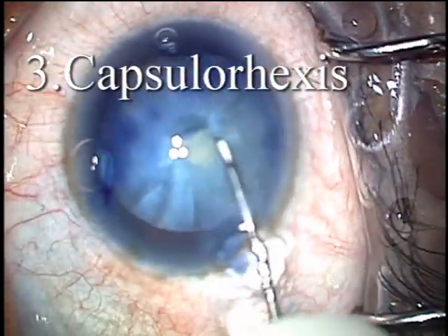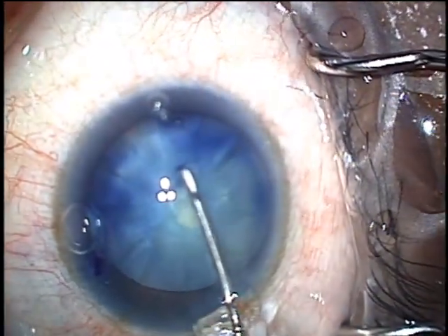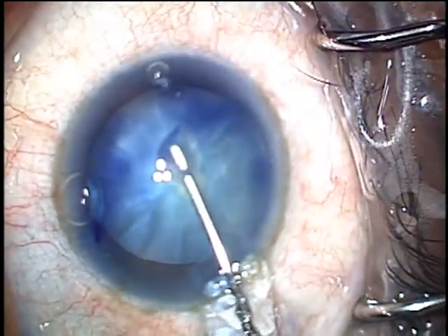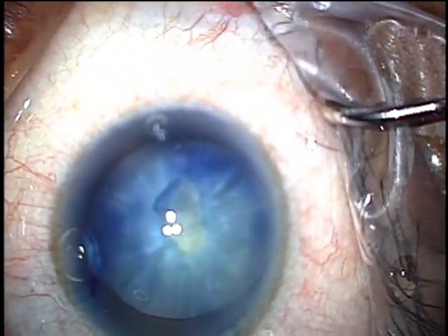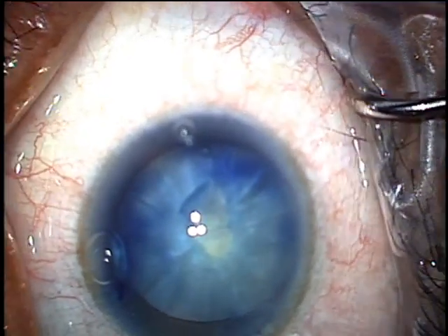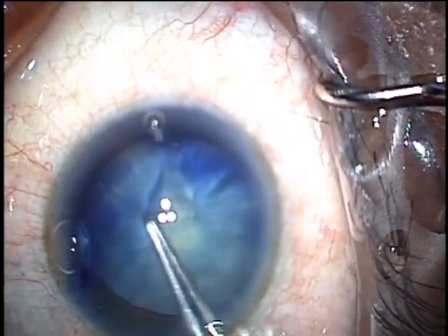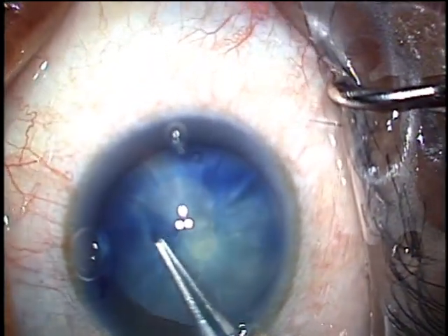Capsulorrhexis is the next step, and we're going to just continue the rent. You can do it wherever it looks convenient — I like to go opposite to my incision. You can continue the capsulorrhexis with the cystotome or switch to forceps. Here, I'm using Utrata forceps. Try to make your capsulorrhexis rather small because it tends to naturally widen. Re-grab continuously.